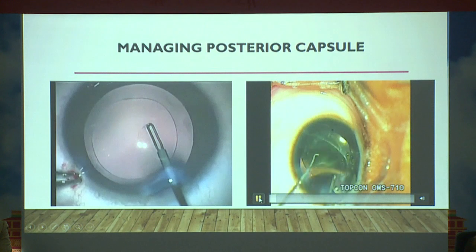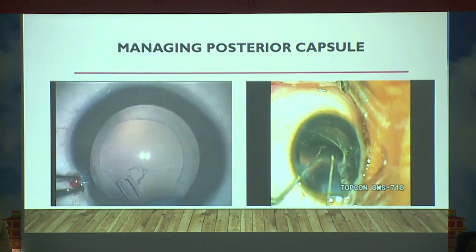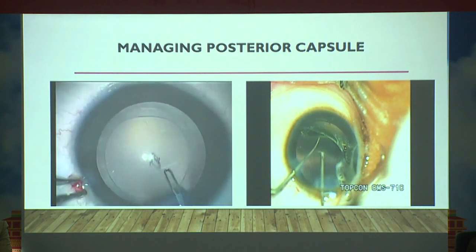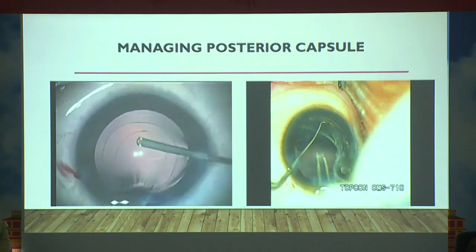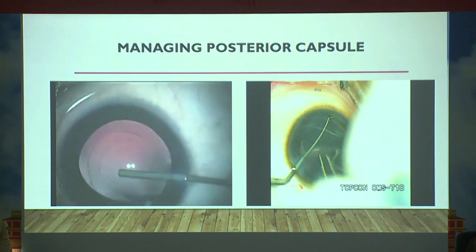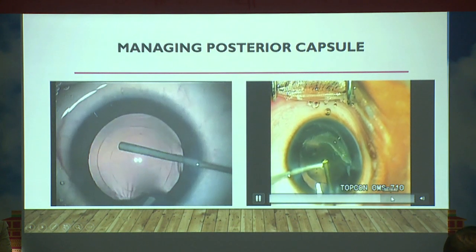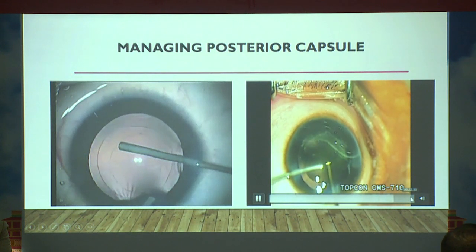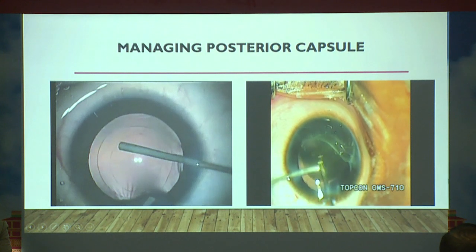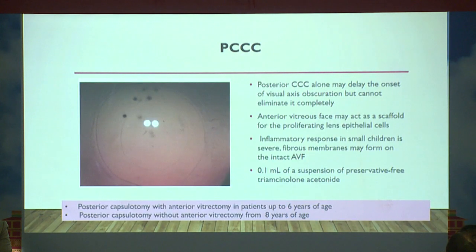You can put in the intraocular lens, hold the lens up, do the prick, do your capsulorhexis in these cases, and then you can use your forceps to complete the capsulorhexis, and then do a vitrectomy in these cases. But this technique is more difficult, but in some cases you can go about doing it. But the main important thing is taking care of the PPC.